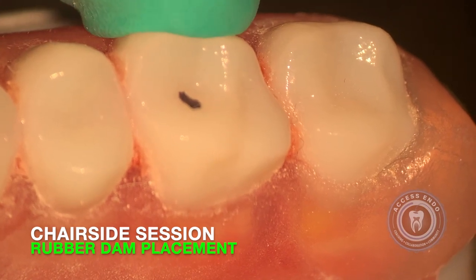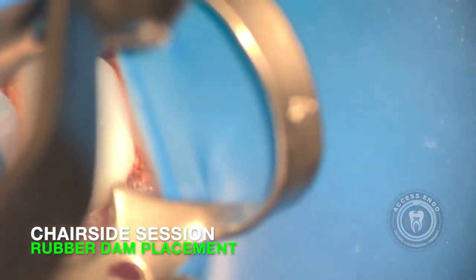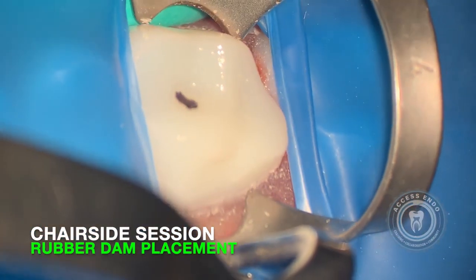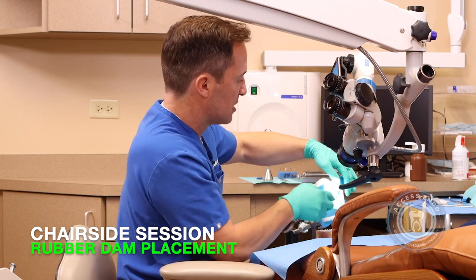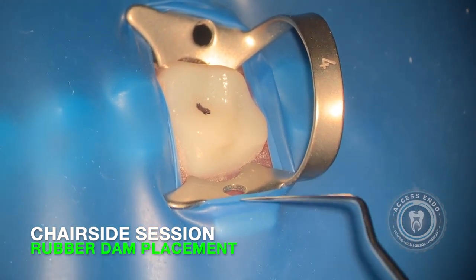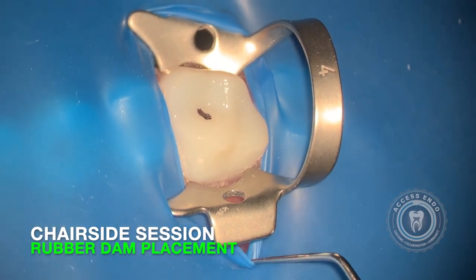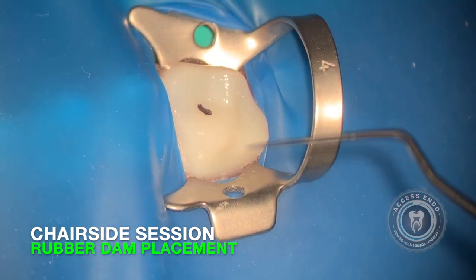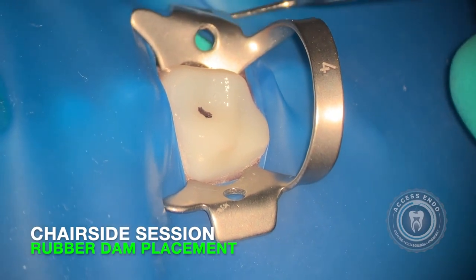I always like to put my finger on the buccal aspect — this allows me to get the cheek and the lip out of the way. And we can always look through the rubber dam to identify exactly where we are. I can see that Sharpie marker loud and clear. I'm going to spread the wings pretty deep, give a good push on the rubber dam forcep, and when I release it, it's right there in position. We'll turn the flap back to make sure it's out of the patient's nose. Then we use our endodontic explorer to release the wings. On the palatal, I have more flexibility because the palate is vaulted. But on the buccal, I always want to make sure I get the patient's lip or cheek out of the way — I've moved the patient's lip out of the way so I can just release the wing very effectively.